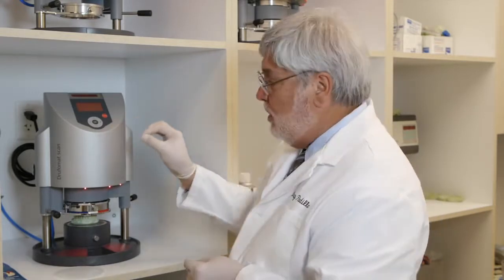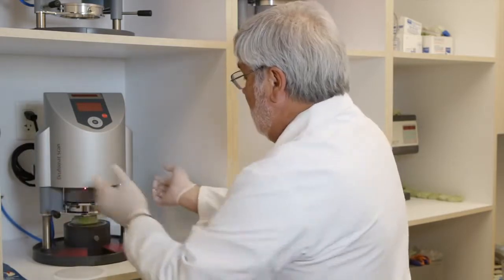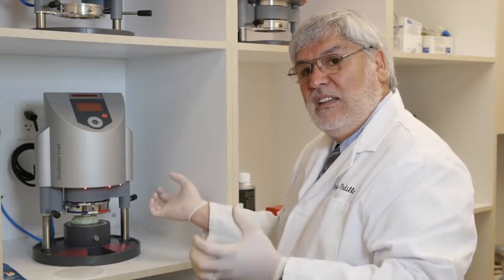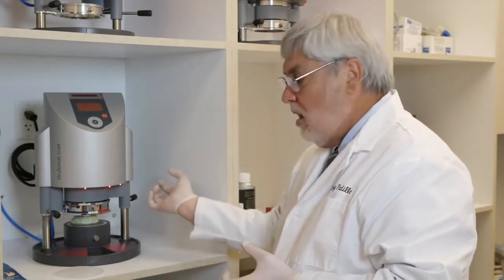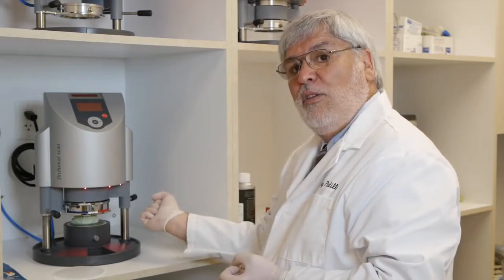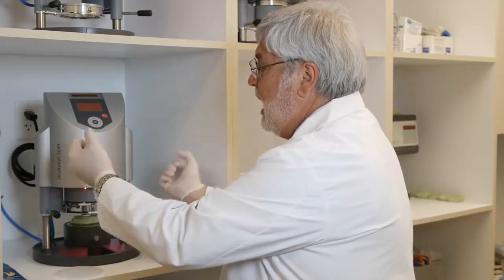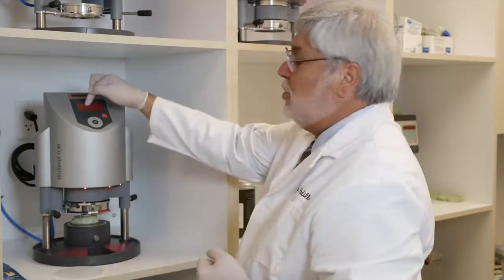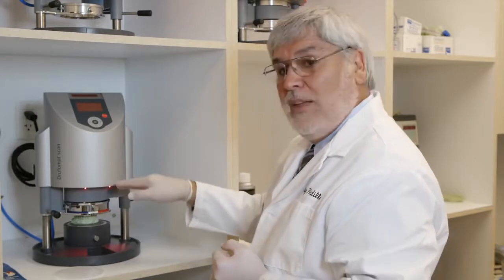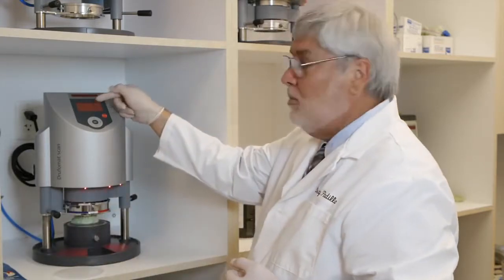When you hear the beep, you press this white button on the left and you pull back the heating element in a continuous, smooth method. Don't jerk it, in a continuous method all the way until you can't pull any further. Press the white button and hold there until you hear a beep and the cylinder is pressurized. Do not let go until you hear that beep.